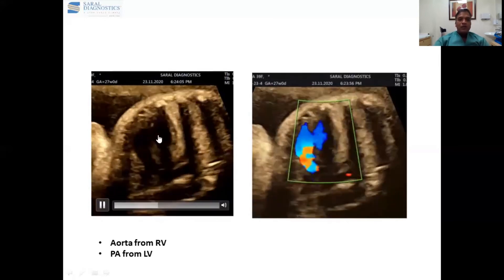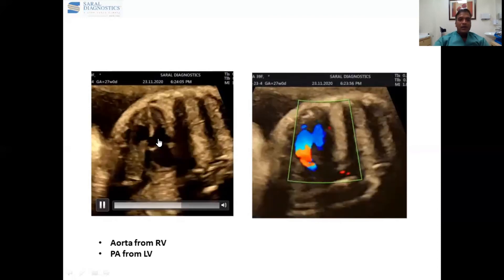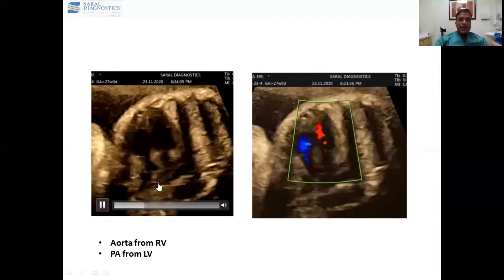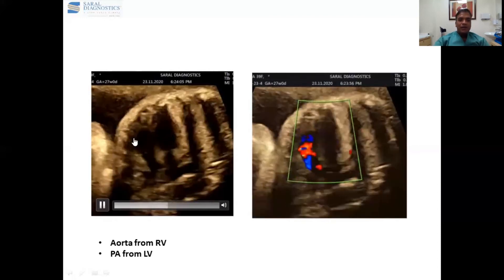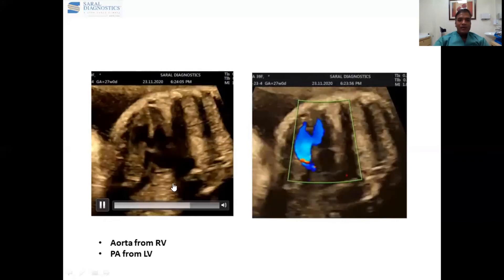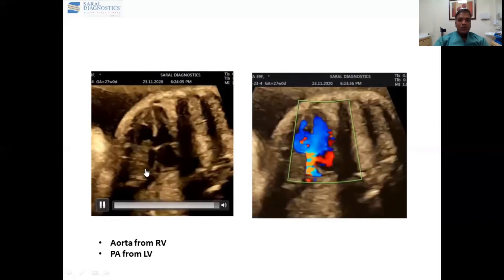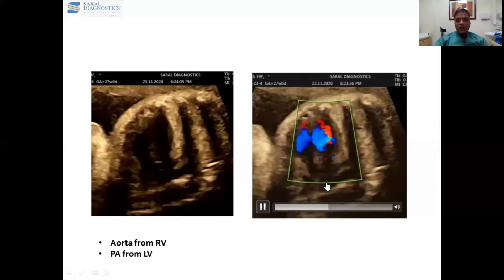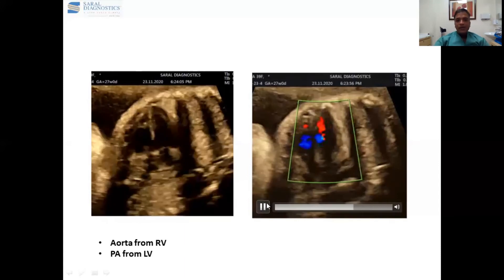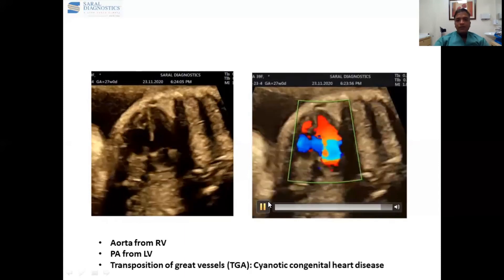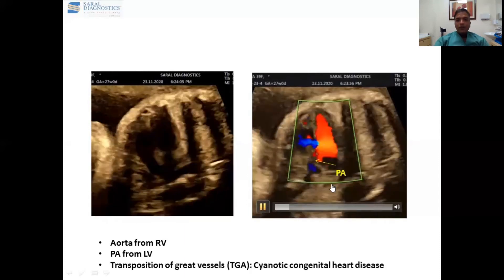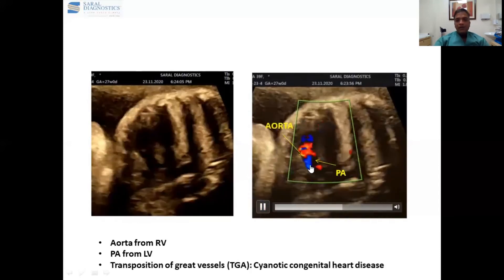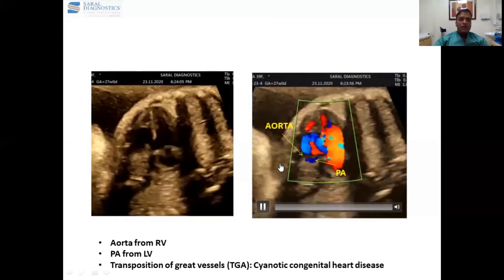There is no crisscross connection as we saw in the previous slide. The pulmonary artery is going like this, and the aorta is going like this — there is no crossing. In the same color flow, this is the pulmonary artery, this is the aorta, and there is no crossing.